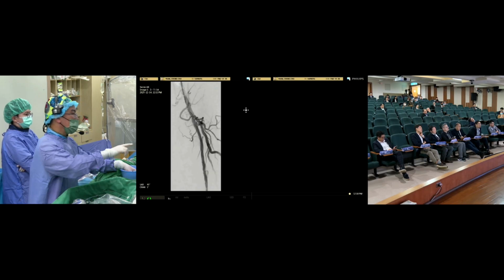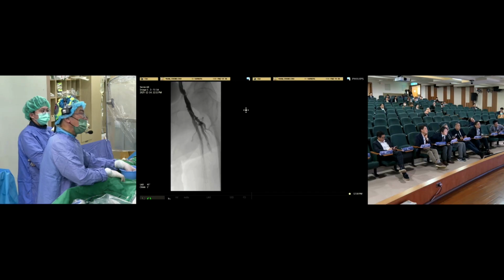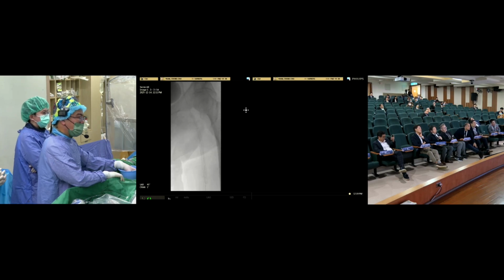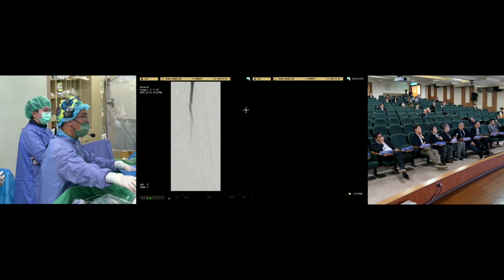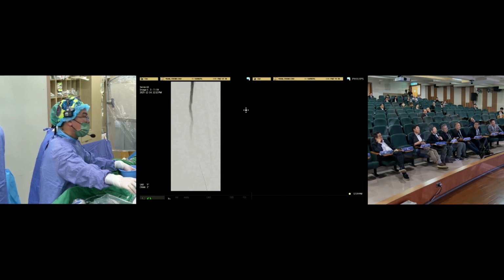And in the angiogram, you can see the ostium seems to have a dissection flap. So I have no idea. Do I need an additional stent or stay here? Well, actually, I need one more stent for the proximal. Yeah, inflow is very important, I think.